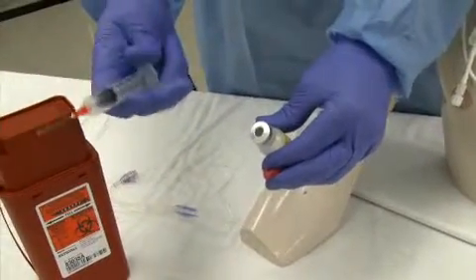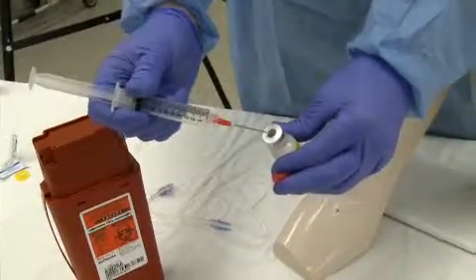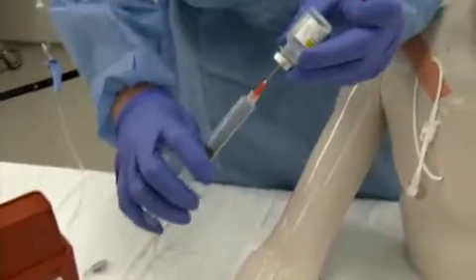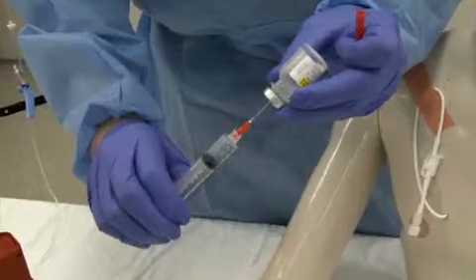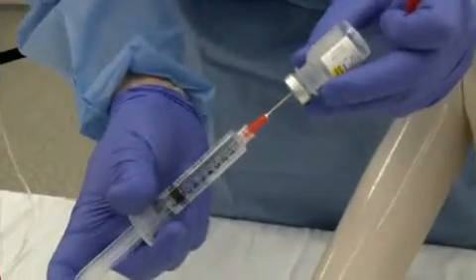Prepare all your equipment in advance. If your service does not carry preloaded normal saline-filled syringes, you will need to prepare one using a 10 cc nebule or vial of normal saline, an alcohol swab, and an empty 10 cc syringe with a blunt access needle.